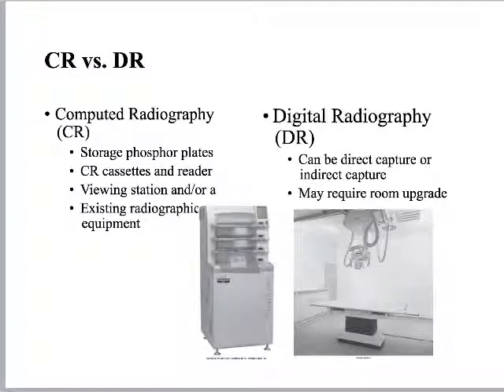So let's talk about this versus that, CR versus DR. Why am I making such a big deal about these two different systems? Well, they definitely distinguish between us in our therapeutic roles as we're doing portal imaging versus us in the X-ray world. In the X-ray world, we kind of really need to know the difference between the two, and it's kind of what we eat, sleep, and breathe.